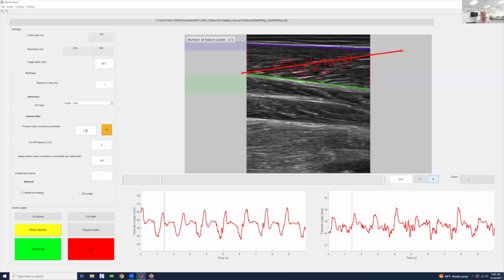it is a good thing to compare these measures that we get here, which is from an intermediate tracking between optical flow and line detection. But what we can do is change this parameter in this box and make it much, much smaller towards what would be optical flow.